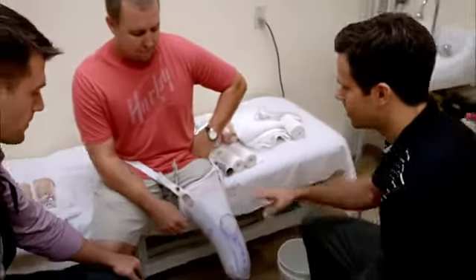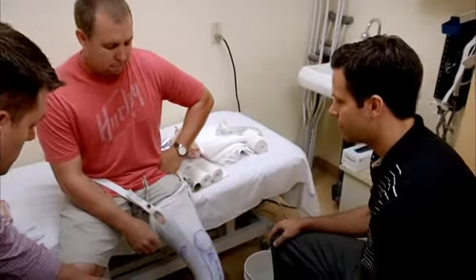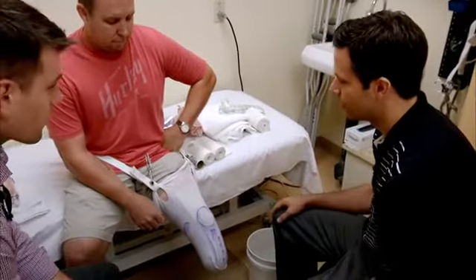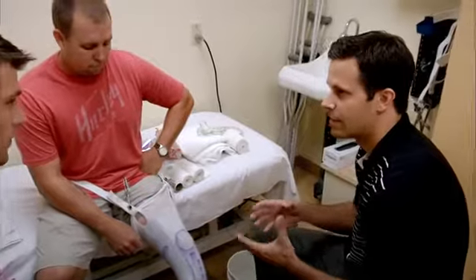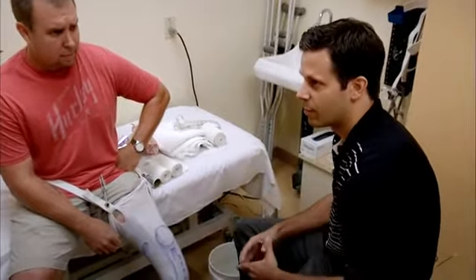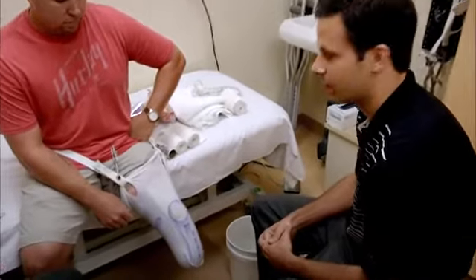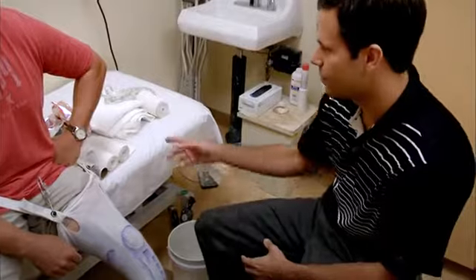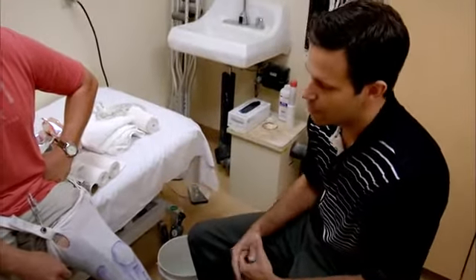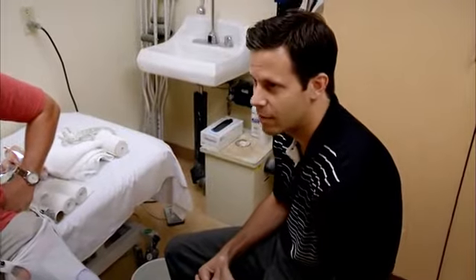We've set Nate up here using the sock that you sewed earlier. We've marked out all the bony prominences, which will transfer over to the mold. What we're going to do is take a cast that we will remove — that'll be the negative — which we will later fill with plaster to have a positive mold of his limb. We've also marked out measurements for overall circumference, and we're going to use plaster to wrap and get the volume as well as shape the limb a little bit.